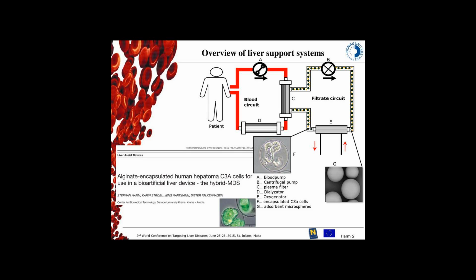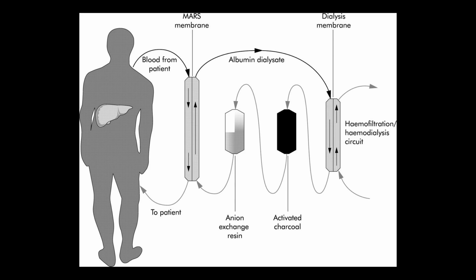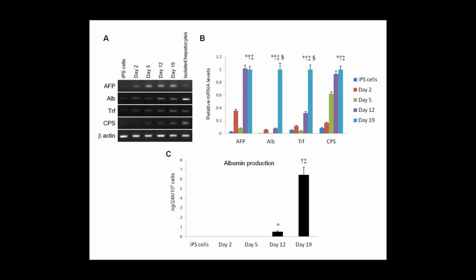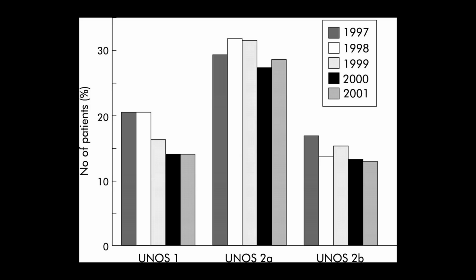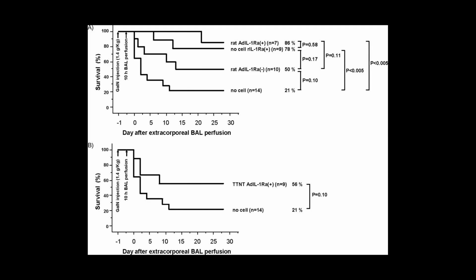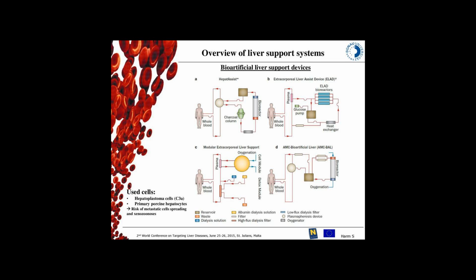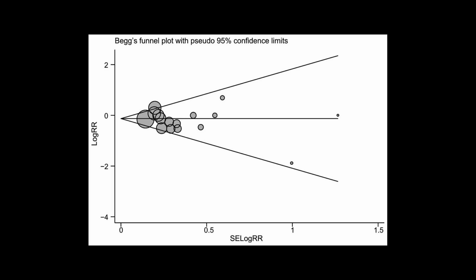Liver cells obtained from an animal were used instead of developing a piece of equipment for each function of the liver. The structure and function of the first device resembles that of today's BALs. Animal liver cells are suspended in a solution, and a patient's blood is processed by a semi-permeable membrane that allows toxins and blood proteins to pass, but restricts an immunological response.